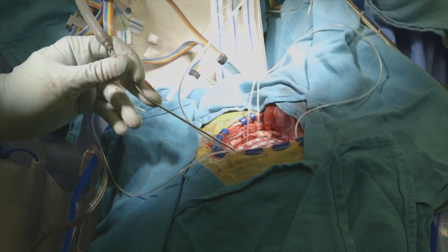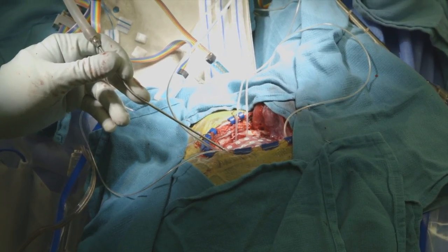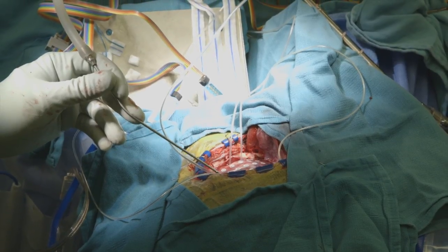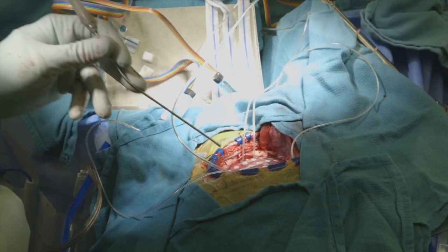We lay them down on the surface of the brain. We test them to make sure they're working. And then we put the bone back and we close everything up as if we were never there. Then she'll spend as much time as we need in the epilepsy monitoring unit.